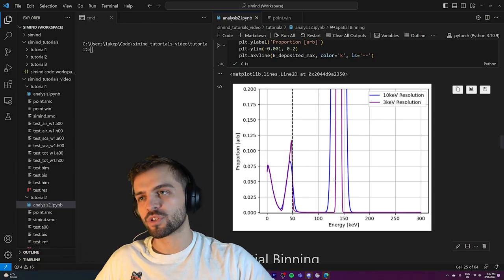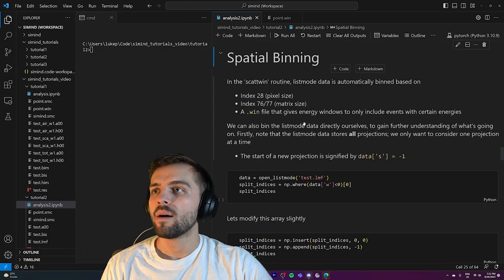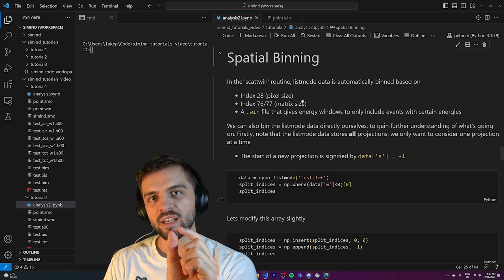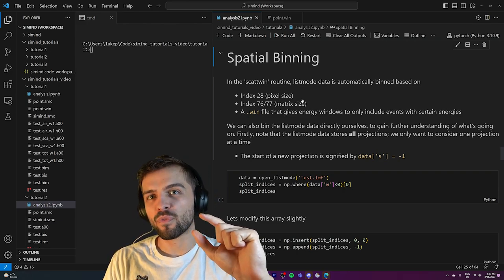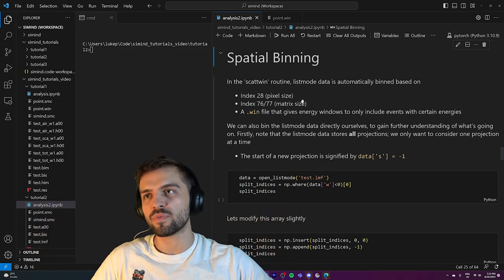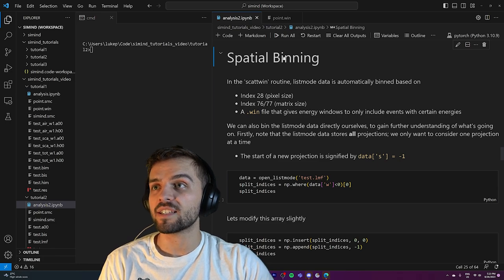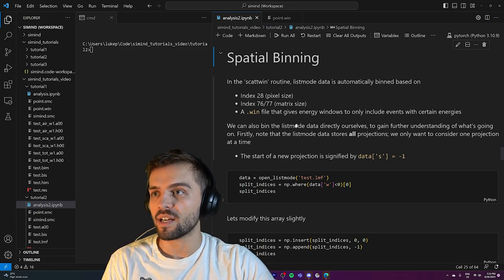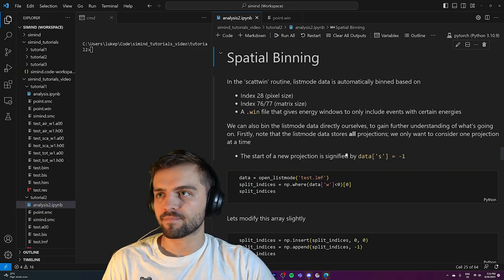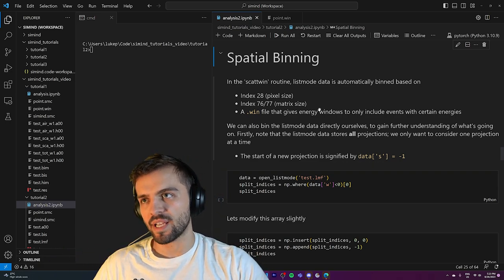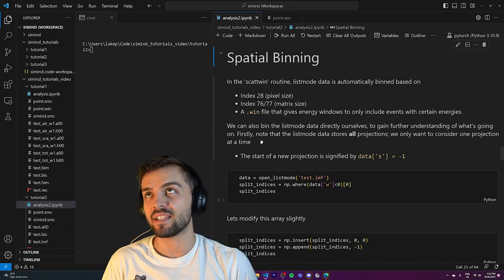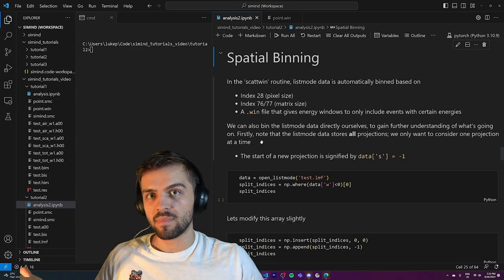We'll use that when we do further simulations in this tutorial series. But the scatter window routine also bins by pixel size and matrix size. Last time we changed from 0.4 centimeters to 0.2 centimeters and from 128 to 256 by 256. But if we have access to the list mode data, we can actually do this ourselves as well. Let's think about how we can bin the list mode data ourselves — this is a really good exercise in understanding how SPECT data is stored and interpreted.